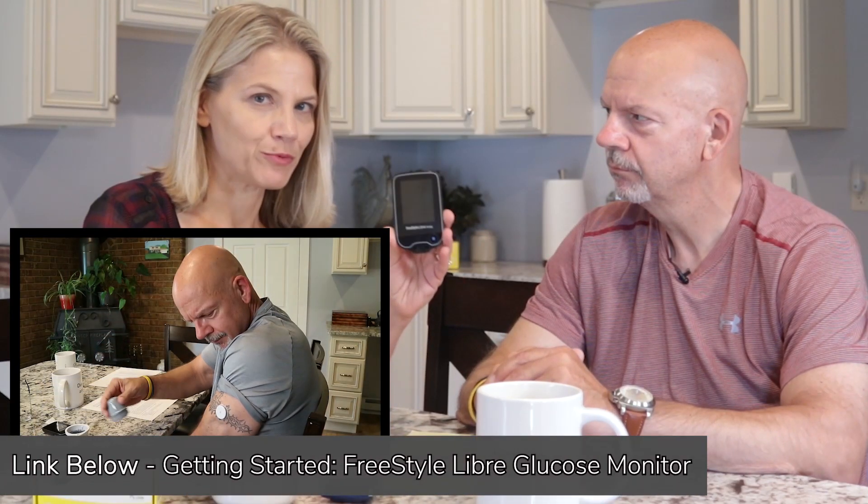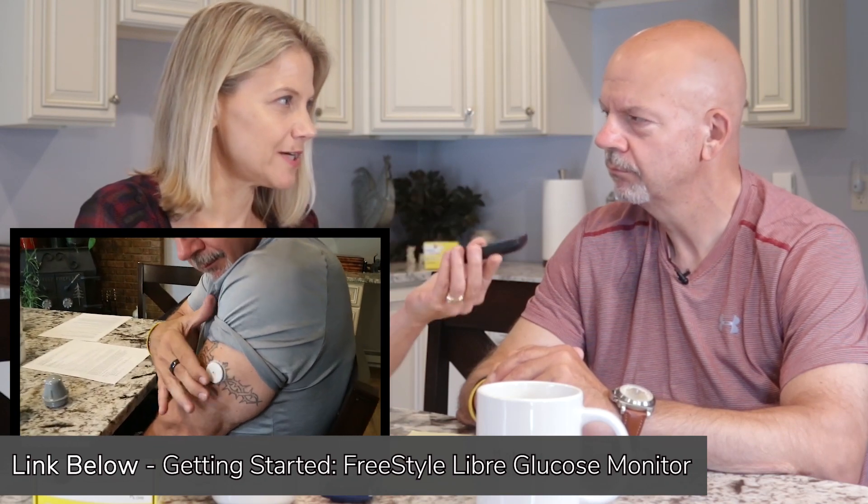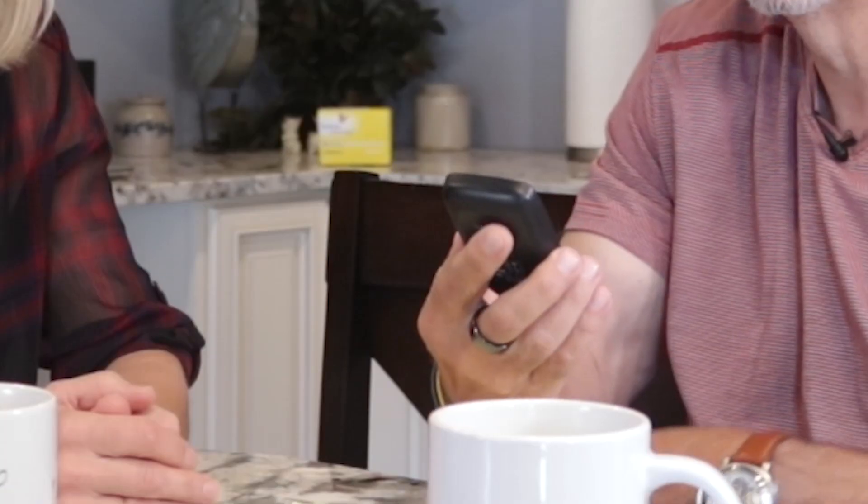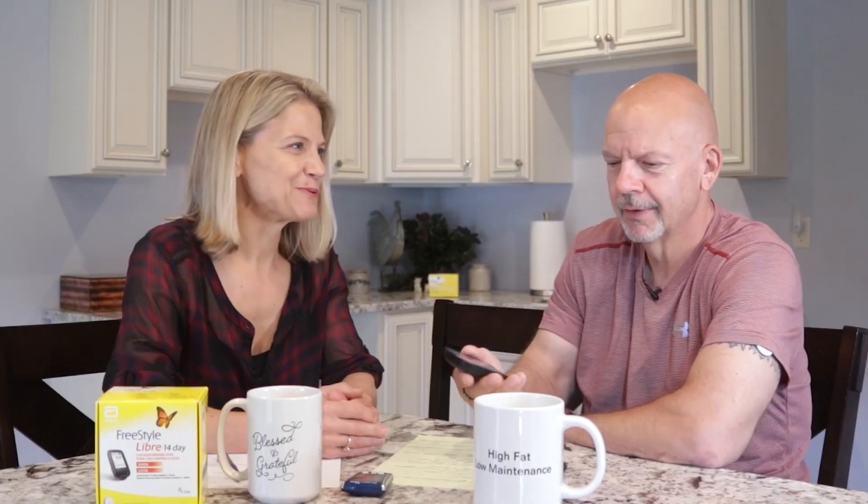He used the Freestyle Libre reader to test. So I have the sensor on the back of my arm. Turn on the reader and you get a reading — 55. Which we can't get past that, right? Because that is obviously a very low blood glucose. We're expecting maybe more in the 80s, which would be a little bit more conducive to life.